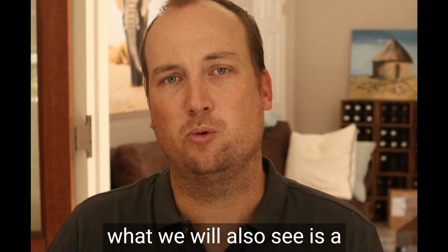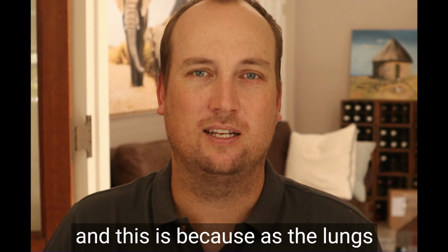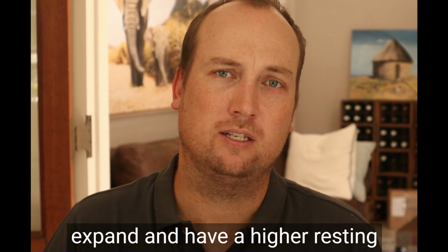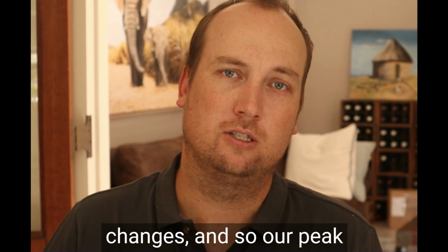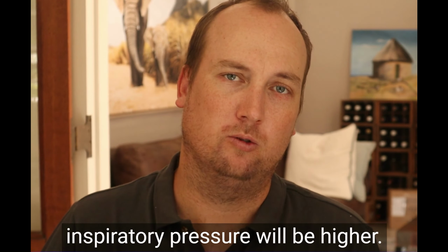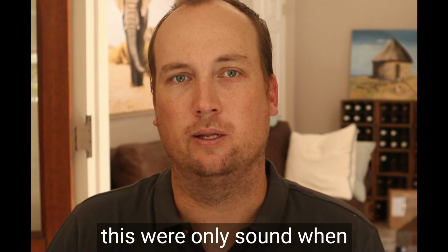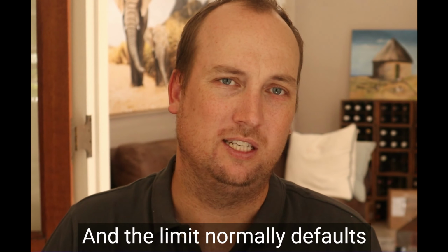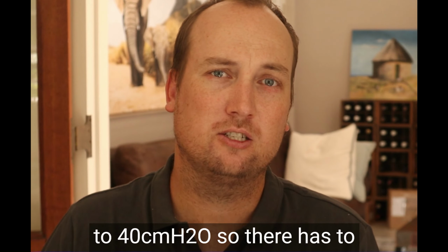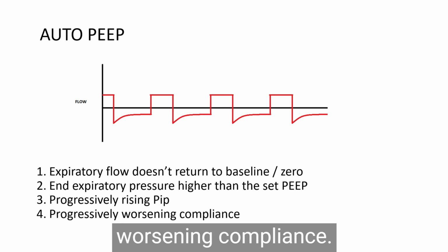What we will also see is a progressively rising peak inspiratory pressure. And this is because as the lungs expand and have a higher resting volume and their resting pressure is increased, their compliance changes. And so our peak inspiratory pressure will be higher. Unfortunately, the alarms for this will only sound when the peak inspiratory pressure is higher than the set limit. And the limit normally defaults to 40 centimeters of water. So there has to be quite significant auto-PEEP before this alarm will trigger. And then what one will also see is progressive worsening compliance.